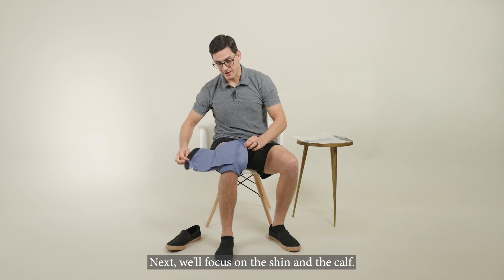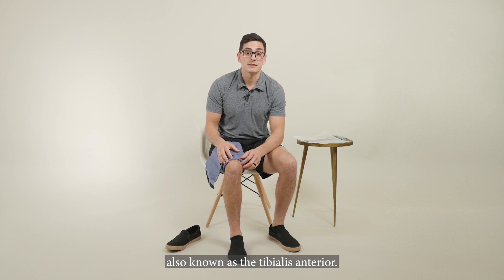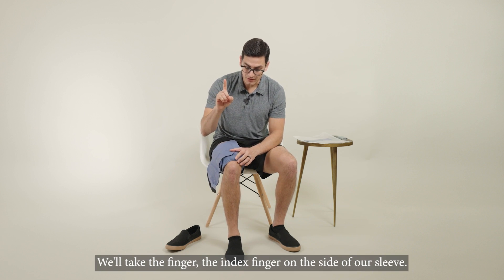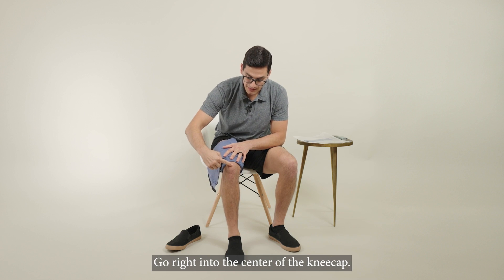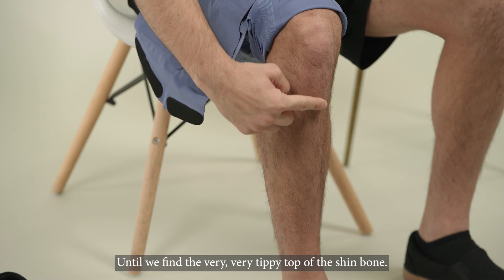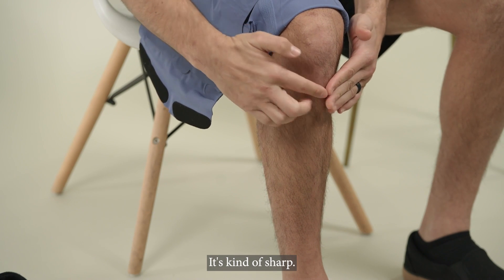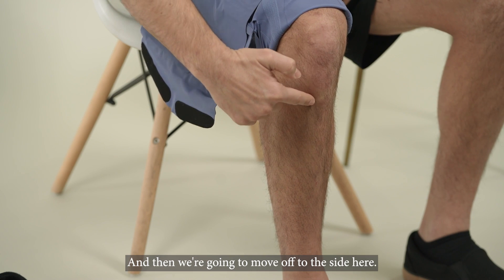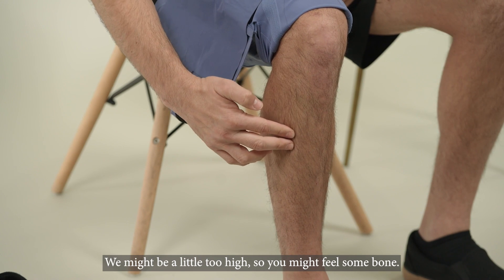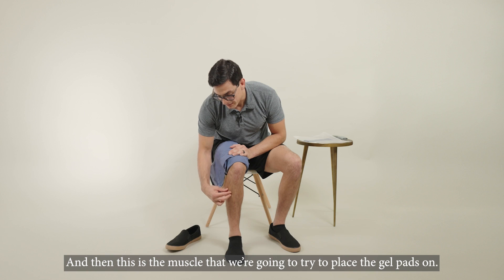Next, we'll focus on the shin and the calf. The first thing we're going to do is identify the shin muscle, also known as the tibialis anterior. We'll take the index finger on the side of our sleeve and go right into the center of the kneecap. We're going to go straight down past the patellar tendon until we find the very tippy top of the shin bone — it forms like the bow of a ship, it's kind of sharp — and then we're going to move off to the side. We might be a little too high, so you might feel some bone. Just go down an inch or two, and this is the muscle where we're going to try to place the gel pads.